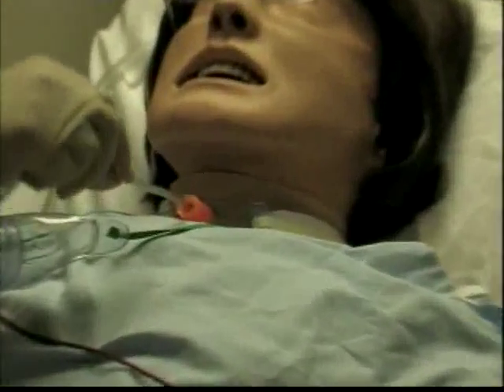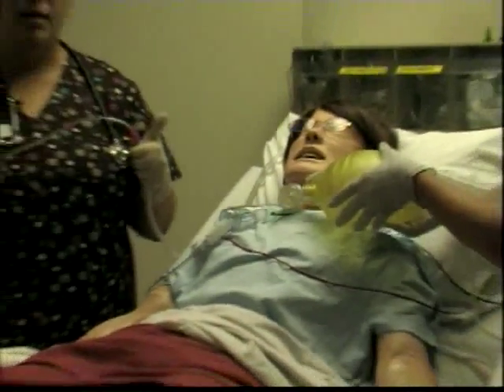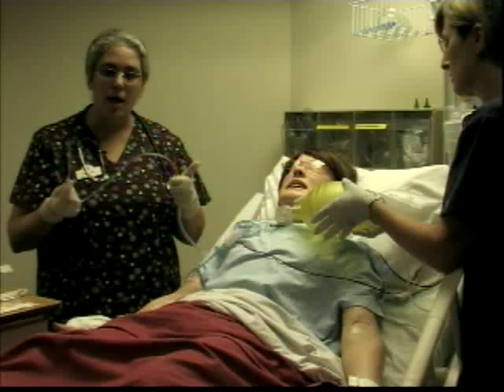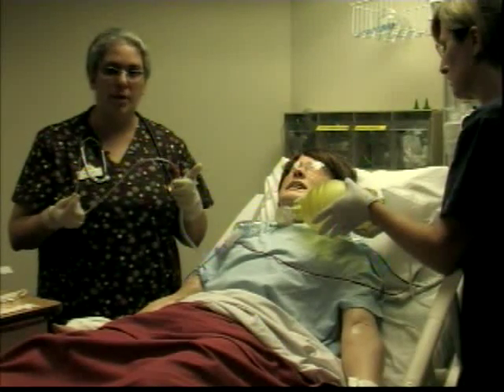We're going to introduce the catheter. If she starts coughing or you go 1 to 2 inches down, then I'm going to apply intermittent suction. At the same time, I am doing circular motion, remove, and she's going to hyperoxygenate. I mentioned no more than 1 to 2 passes because that decreases the oxygenation under your client, and you need to allow the client to recover from the suction.